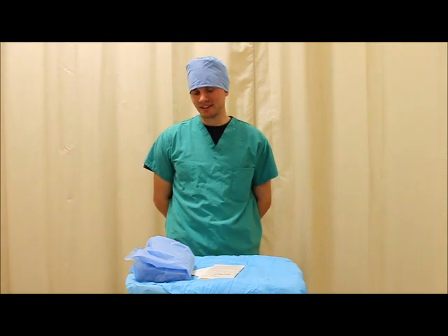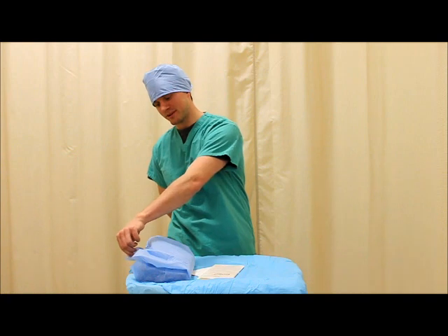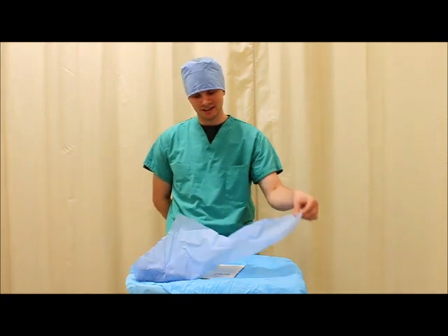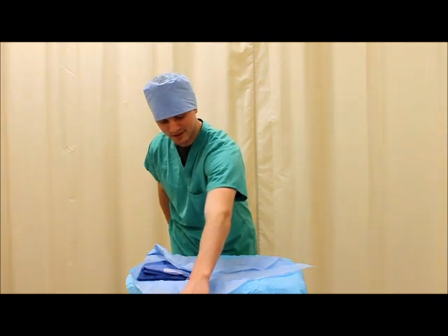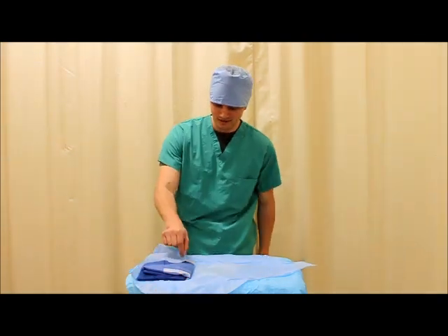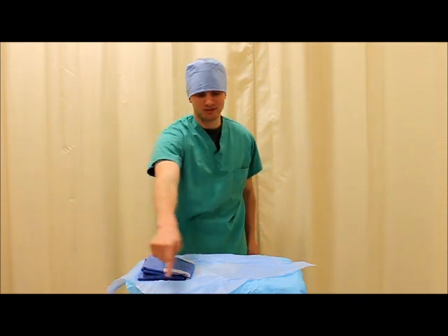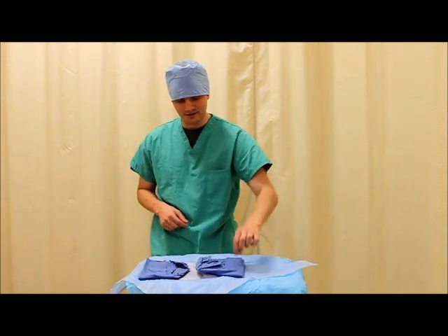Today I'll be demonstrating how to set up a sterile tray in a sterile environment. First, we're grabbing the edge corner, and remember just to touch only the corners of the blue cloth. We consider everything hanging off the edge to be unsterile, and an inch within the perimeter of the cloth to also be unsterile. Now we're touching the inside of the gown as we unwrap it.